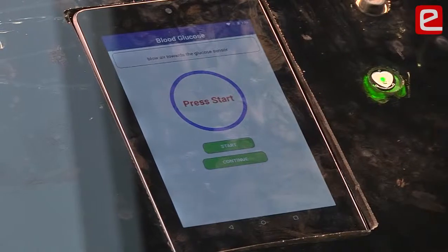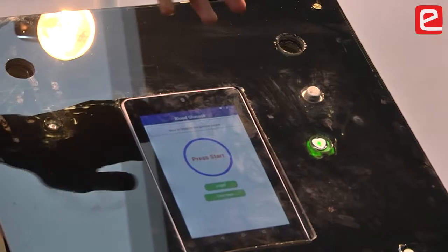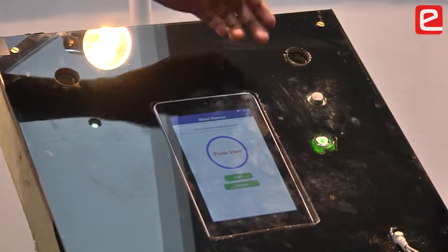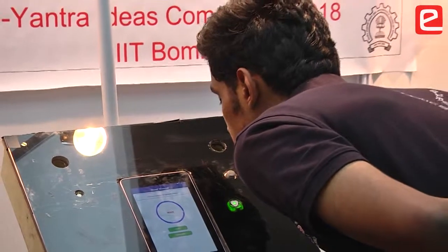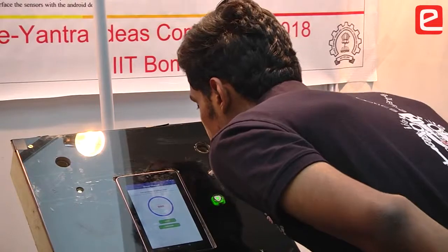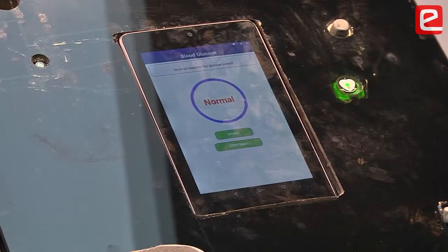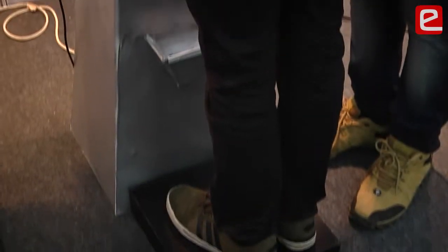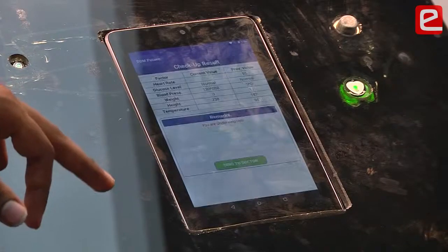Now let's move on to blood glucose level. Blood glucose is measured using an acetone sensor — a non-invasive method where you just blow through the sensor. It predicts whether you are diabetic or not using three levels: high, medium, and low. His glucose level is shown as normal. Next is weight, measured using the weight sensor module below. The weight is measured at 67 kg. We can now view the results using the view result tab.